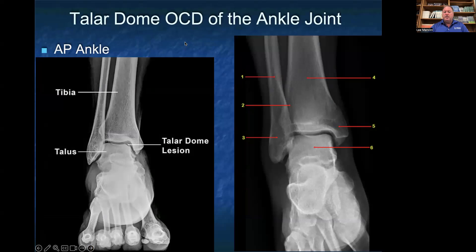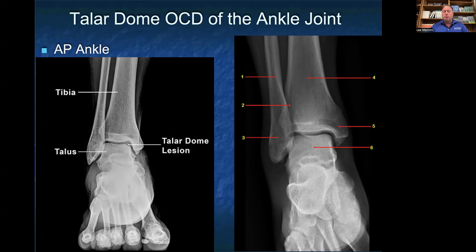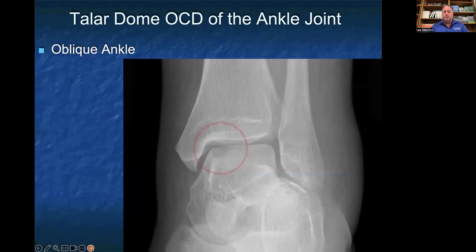When you're looking at the talar dome, that is usually the top part of the talus underneath the tibia and medial to your fibula, and specifically the lateral malleolus. The most common site of a talar dome OCD is that medial aspect of the talus right lateral to the medial malleolus of the tibia. This is where you would look on an AP view of the ankle. On an oblique view, which sometimes gives you your best view of a talar dome OCD, you can see inside this red circle a lucency consistent with or suspicious for a talar dome OCD.